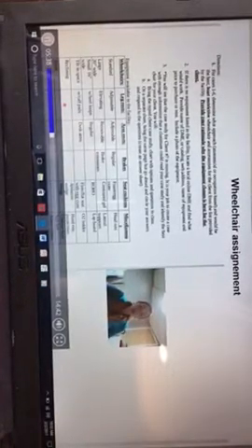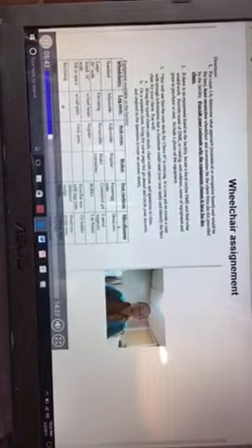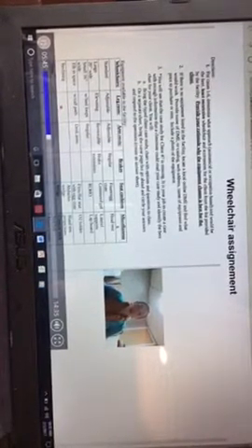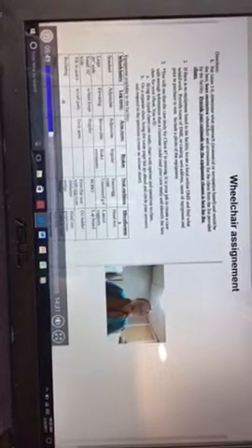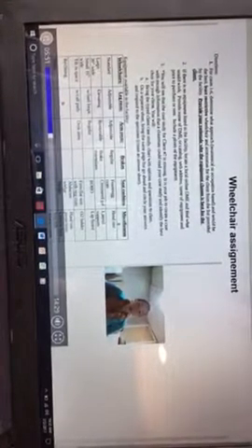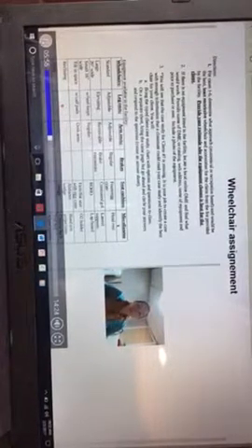Removable arms are really important to think about if you have a full-time wheelchair user that needs to be able to do a slide board transfer out of the chair. That's really important to think about. What kind of transfers are they going to be doing? Are they going to be able to clear an armrest that's not removable?